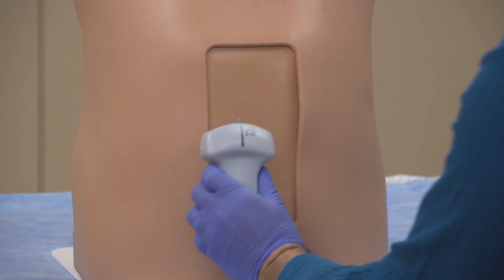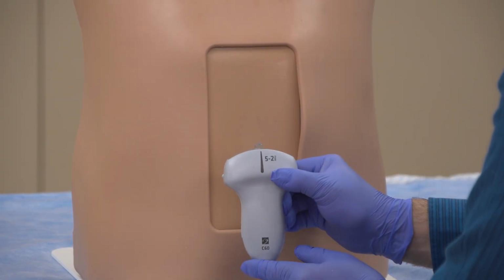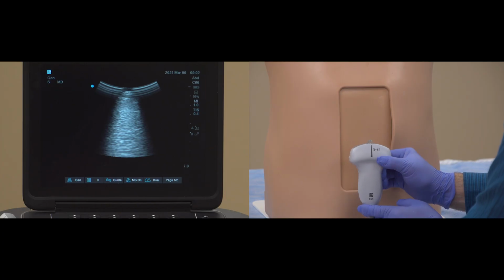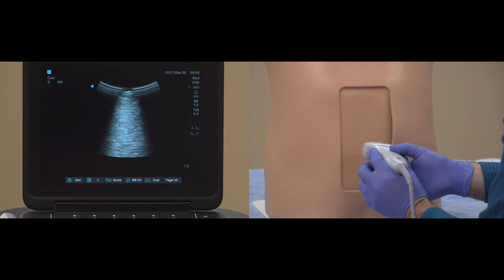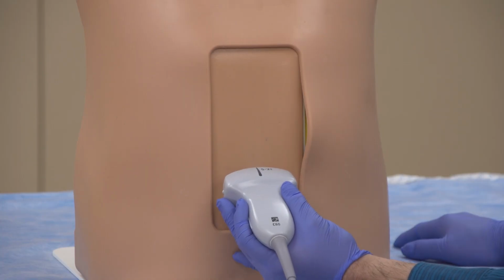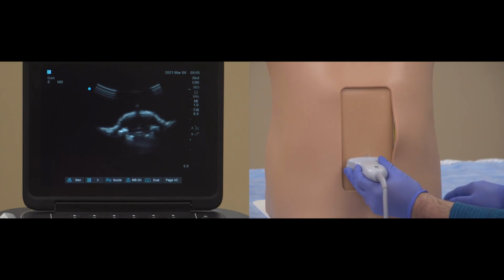Recall that on an ultrasound, calcific bone appears as a hyperechoic bright white line with anechoic shadowing deep to the cortex. Start with the probe in the transverse orientation with the indicator toward the patient's left. Using a small amount of gel, we are going to localize the sacrum, which appears as a long, flat, bony structure with small protrusions of the sacral transverse ridges. Note depth and gain adjustments are made to ensure the structures of interest are occupying the top 2/3 of your screen and are clearly visible.